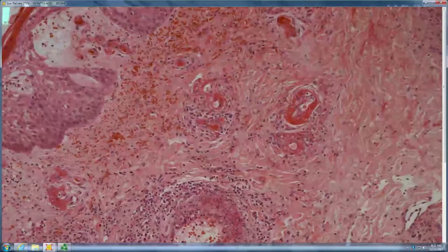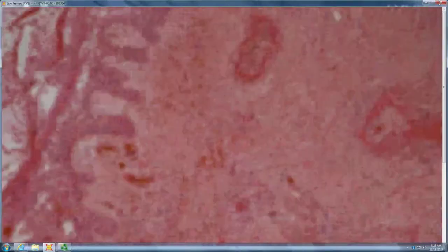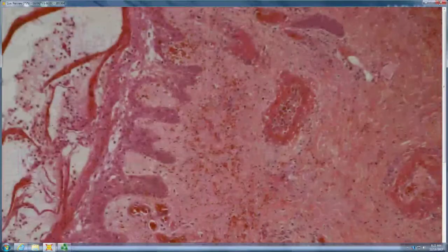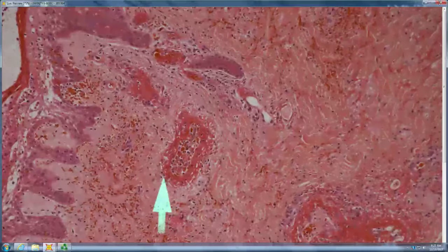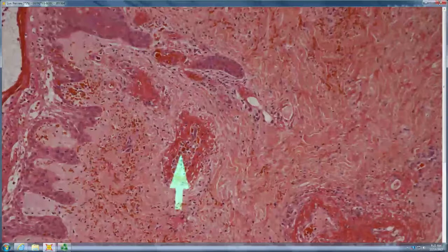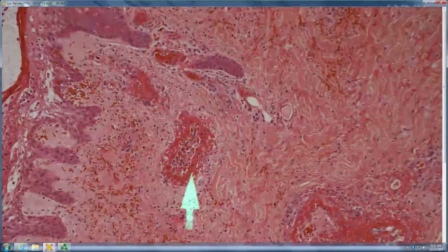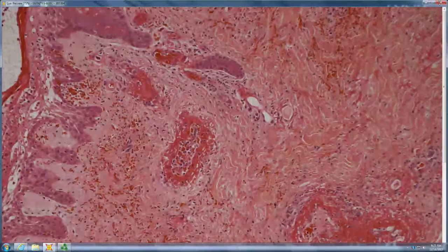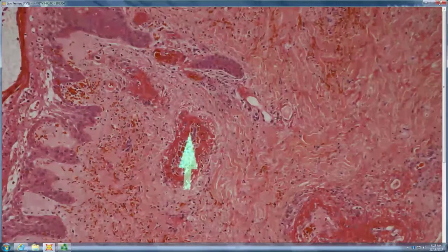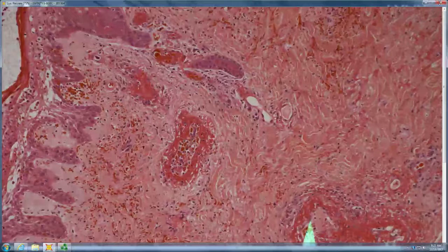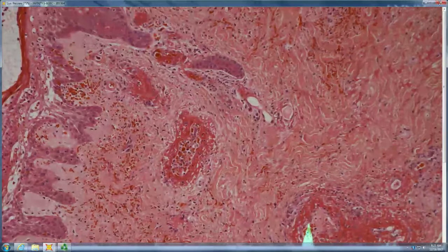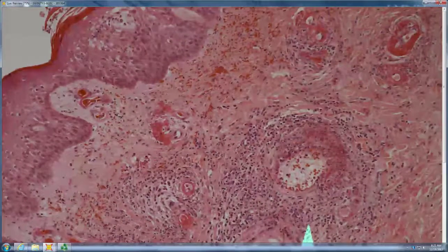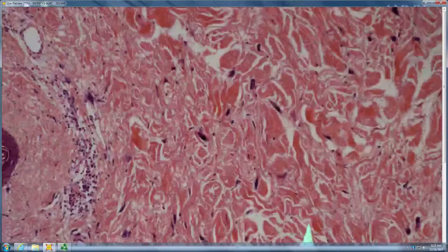I don't think we have a split in the corneum. So you definitely have a split in the corneum with some PAS positive. And then you're going to have to decide what's primary change and what's secondary change. Where do you think the primary is? Around the vessels. Yeah, sort of where the arrow is. Fibrin. Here. Oh, yes. Here there. And so what do you see? Fibrin and karyorrhectic debris. Fibrin and karyorrhectic debris, expansion of the vessel wall. Some sort of small vessel vasculitis. Yeah, so a small vessel vasculitis. Is endothelium gone or is endothelium preserved? I guess it's preserved. Yeah, you can still see oval things. So if it's gone, then you worry more about ANCA, septic, rheumatoid. When it's preserved, it's the other group. The HSP, connective tissue, mixed cryo, cryoglobulinemia, the small vessel vasculitis group.